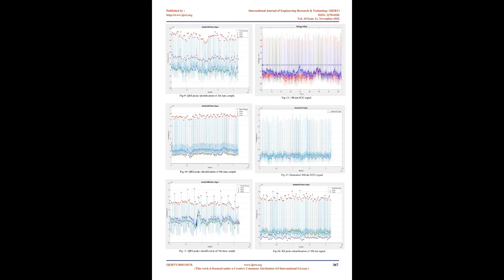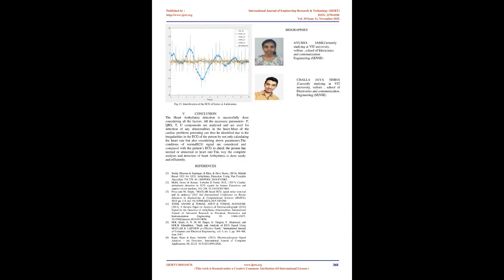Calculation of normal and abnormal heartbeat rates. Heartbeat rate = 60 / RR interval. Normal heartbeat rate equals heartbeat of patients whose actual is 1. Abnormal heartbeat rate equals heartbeat of patients whose actual is 0. Mean normal heartbeat rate equals mean of heartbeat of patients whose actual is 1. Mean abnormal heartbeat rate equals mean of heartbeat of patients whose actual is 0. Distance normal equals absolute of normal minus mean normal heartbeat. Distance abnormal equals absolute of normal minus mean abnormal heartbeat.